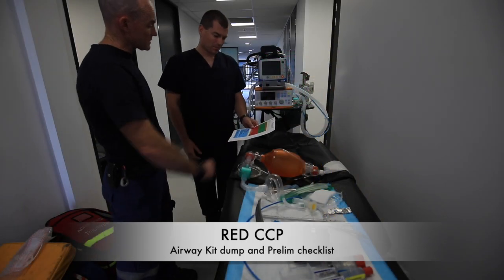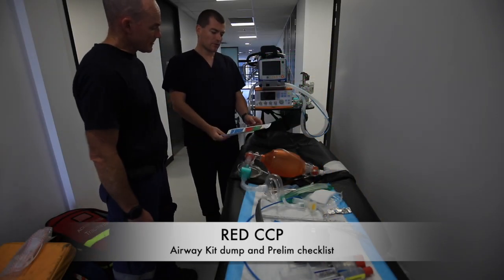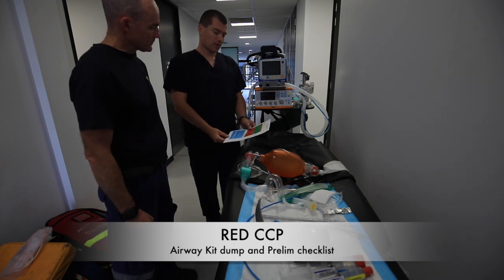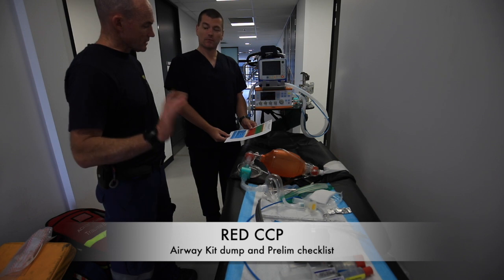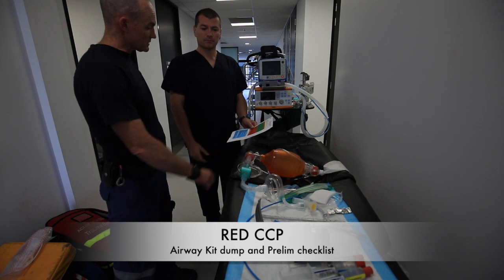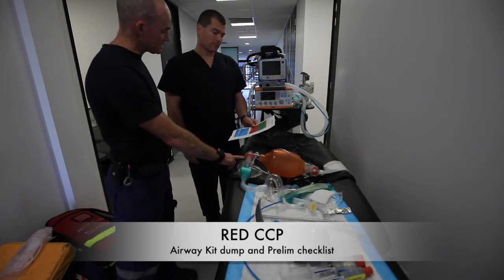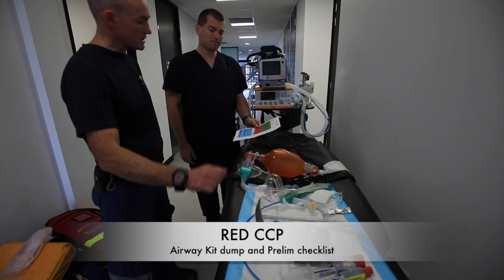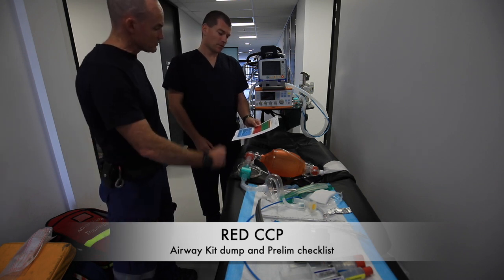Alright Marty, let's run through this checklist from the top. Airway plan verbalized — Claire and I will discuss that inside. Roles allocated — Claire and I are red, you're remaining orange. Drugs and doses — 200mg of ketamine in a 20ml syringe and 200mg of roc in a 20ml syringe, drawn up. Ongoing infusions as per our order.